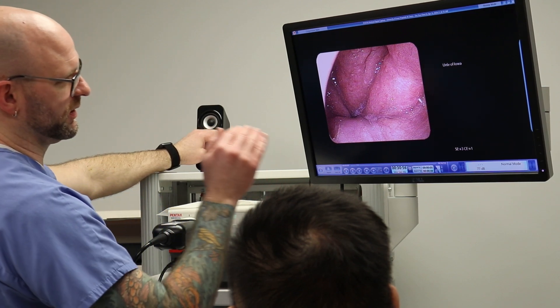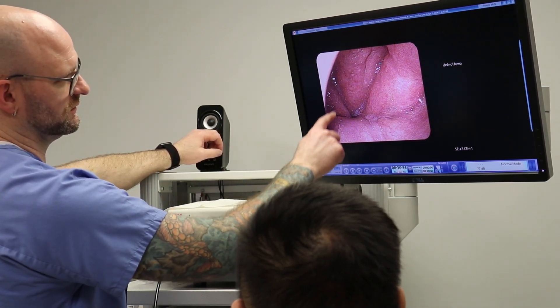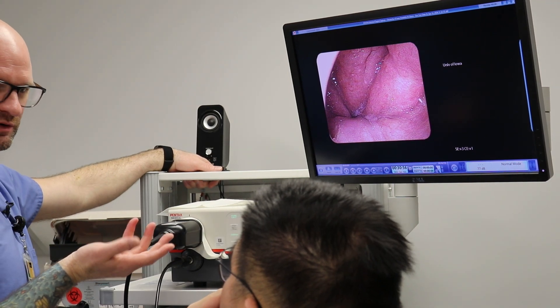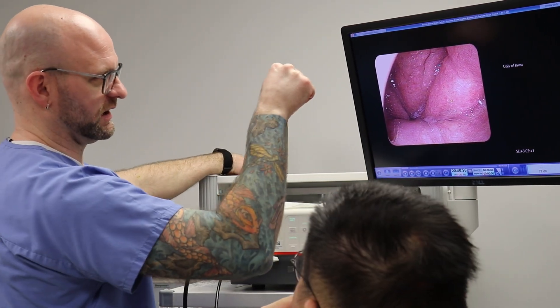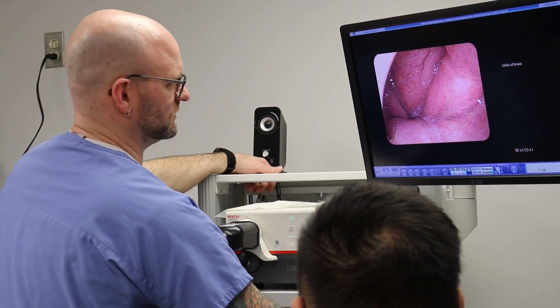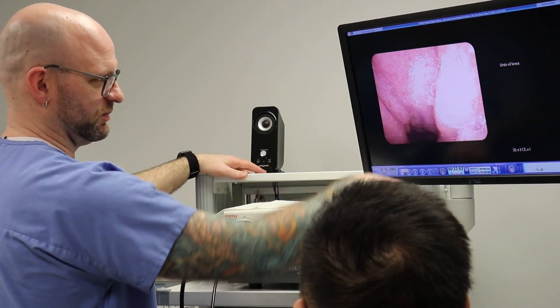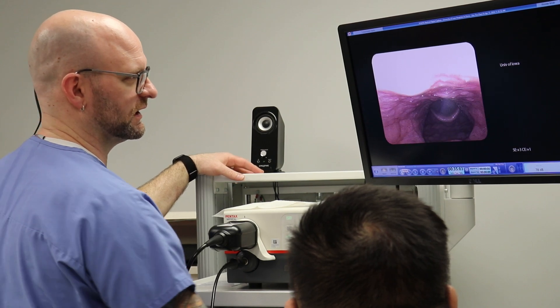This is the very back part of your nose — this is your soft palate. The reason I was saying to breathe through your nose is that when you breathe through your mouth, that closes up and doesn't let anything through. But once you start breathing through your nose, it opens up a clear pathway to get down.